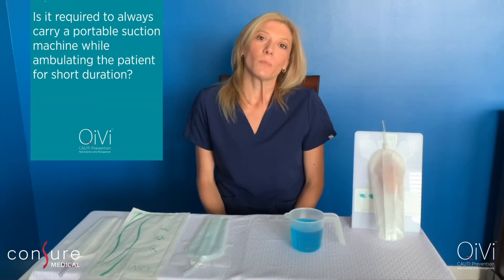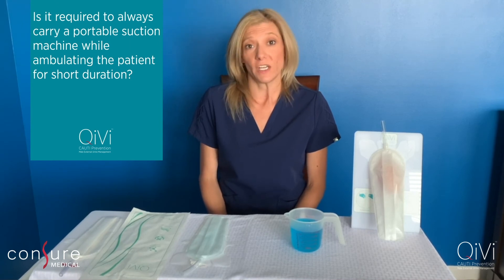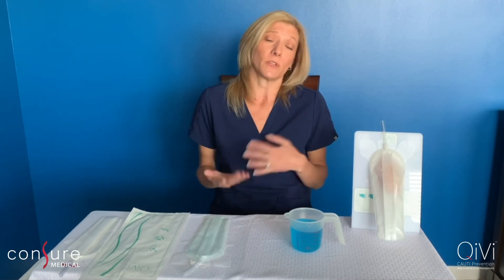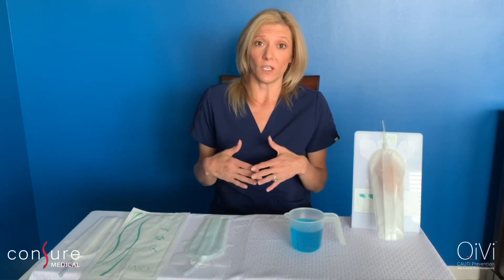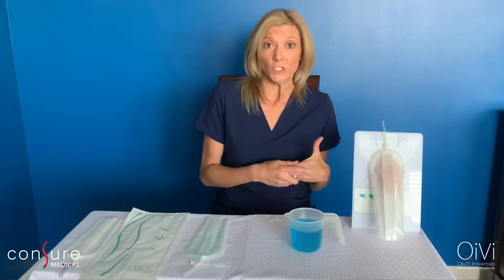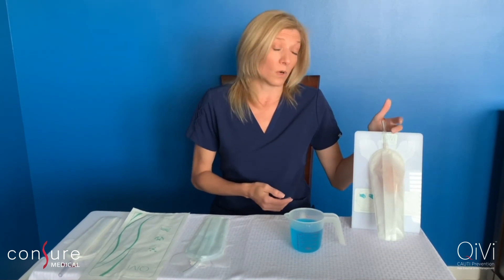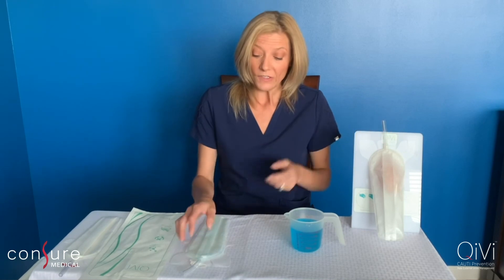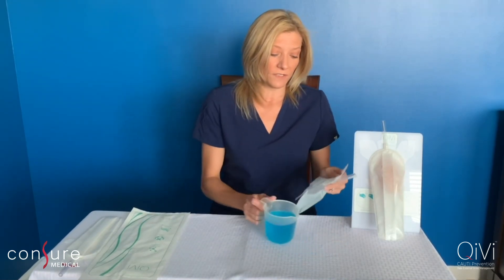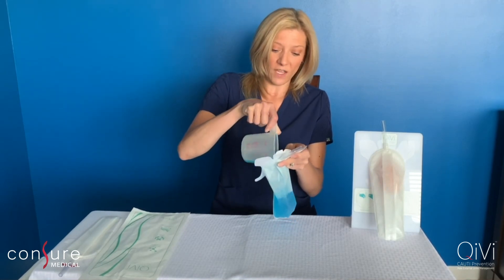Is it required to always carry a portable suction machine if you're just ambulating your patient for a short duration of time? No, you do not need a portable suction machine if you're just ambulating your patient a short period, moving them to a cardiac chair, or they're going down to X-ray. All you need to do is take some Kelly clamps and clamp off the top, or grab a suction cap and do the same. The device itself can hold 250 milliliters of urinary output should the patient void during that short time.